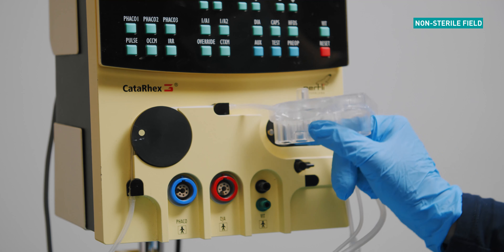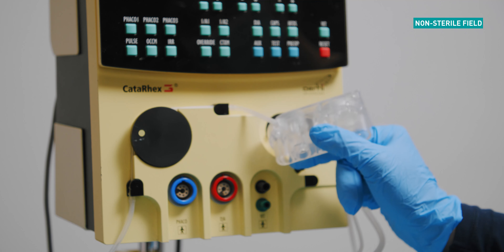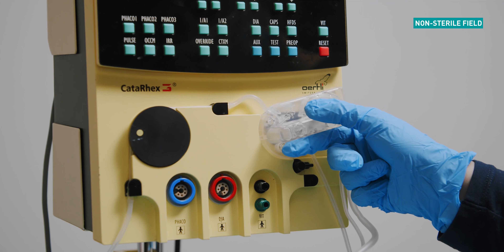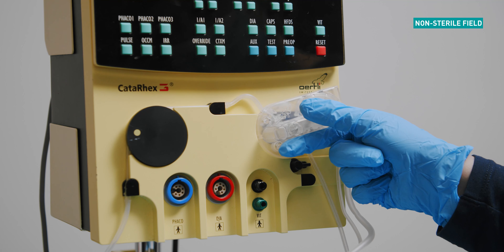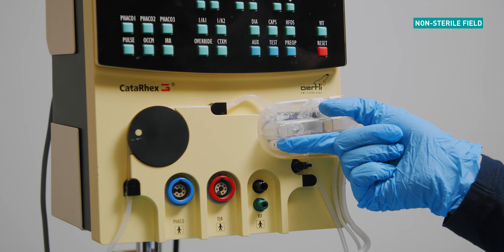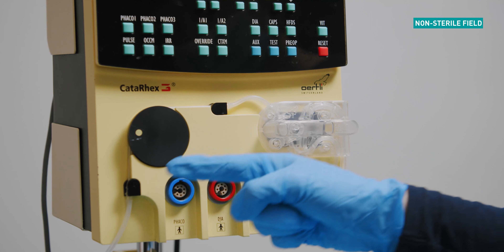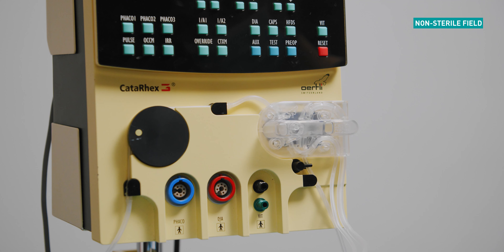Now connect the cassette. Ensure that the guide pin on the back of the cassette lines up with the port on the cassette slot. Holding the cassette at a 45 degree angle, clip the cassette into the locking pins located on the cassette slot. Press the cassette flush against the device. With a downwards motion rotating clockwise, clip the cassette into position.